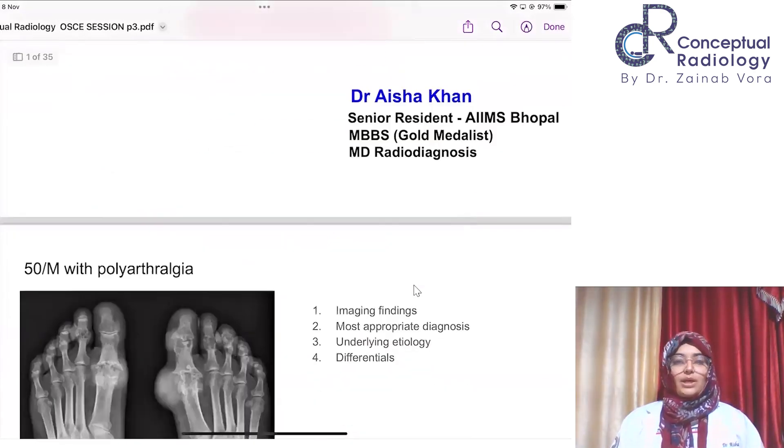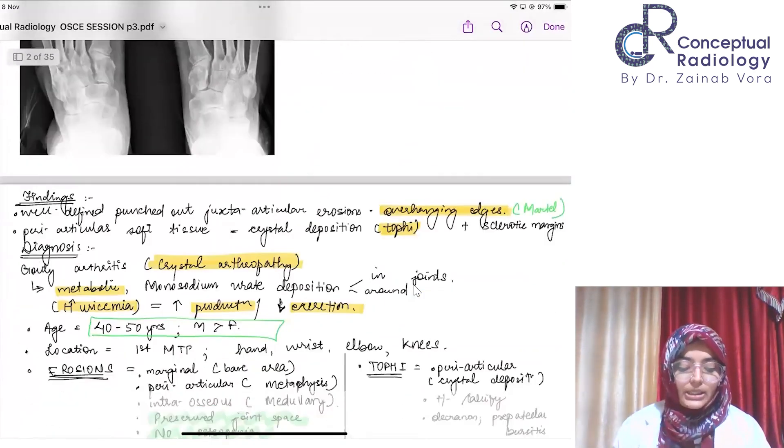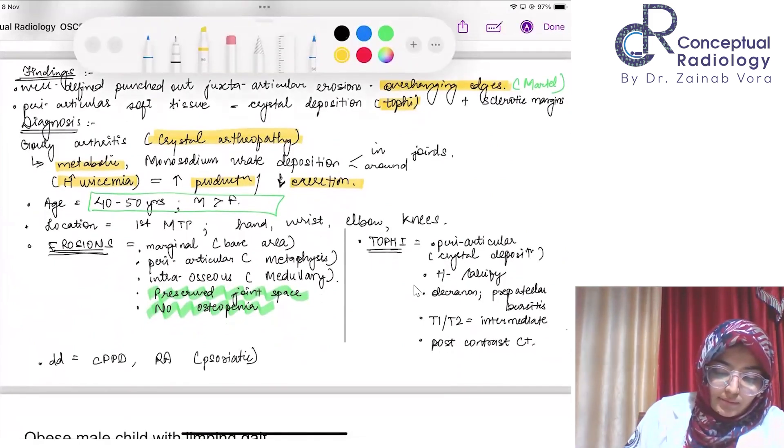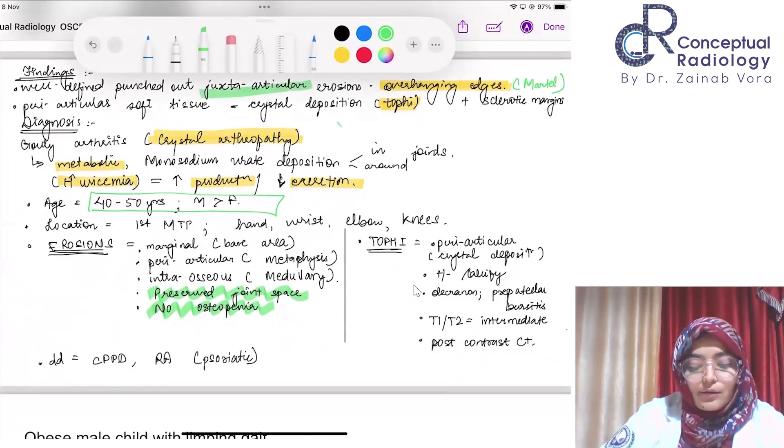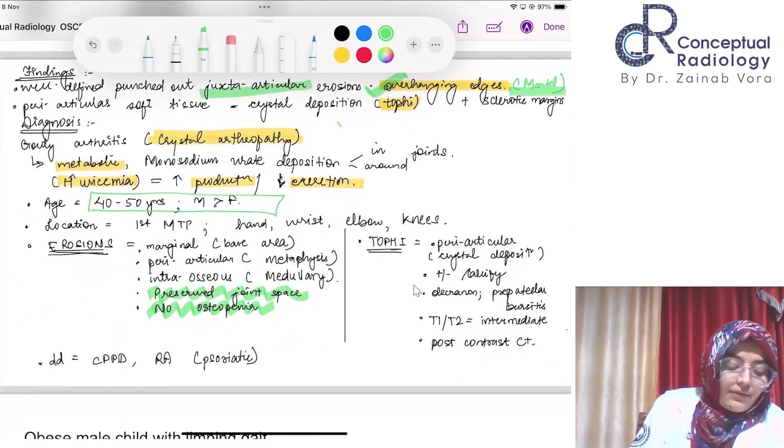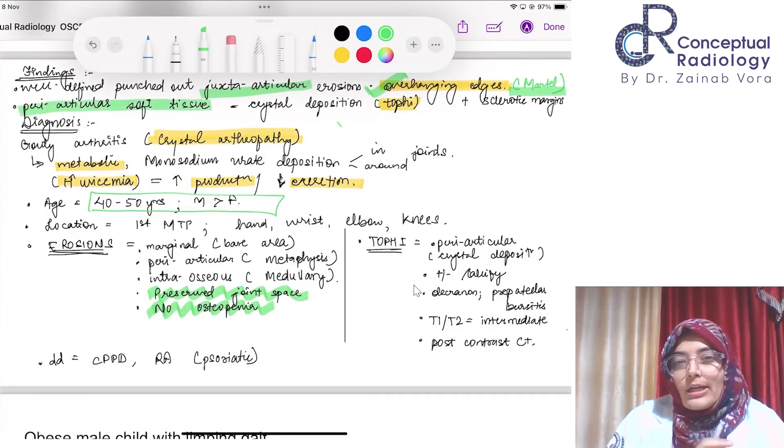Findings: these are well-defined punched-out juxta-articular erosions. We need to remember these are going to be juxta-articular and may also involve the bare areas, like in rheumatoid arthritis where cartilage is deficient. Periarticular and juxta-articular erosions with overhanging edges because there is some reactive new bone formation happening at the edges. This is the famous Martel sign, which was a PG question also.